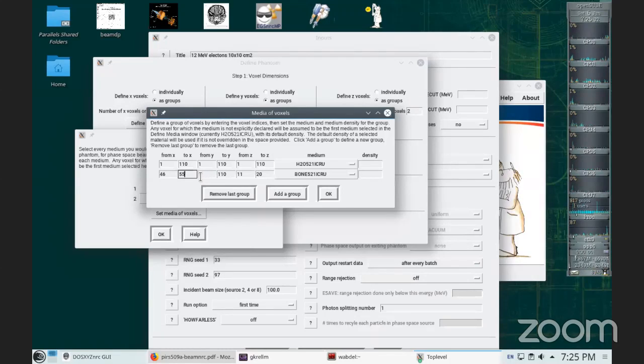And no, we need to actually go to the other side. So 55 plus, we have two times 10, 65. There is some 2 centimeters, yeah, 1 centimeter. So this is 65. Does this make sense or not? Let me think about it. 55, this is 2 centimeters from here. Yes, and we need 2 centimeters from there. That's going to be 65.